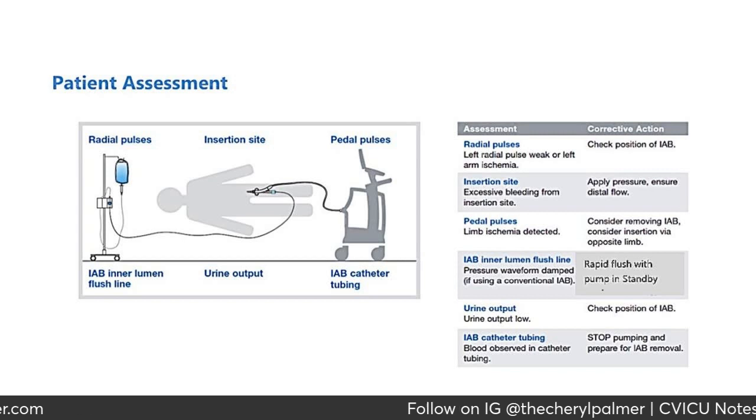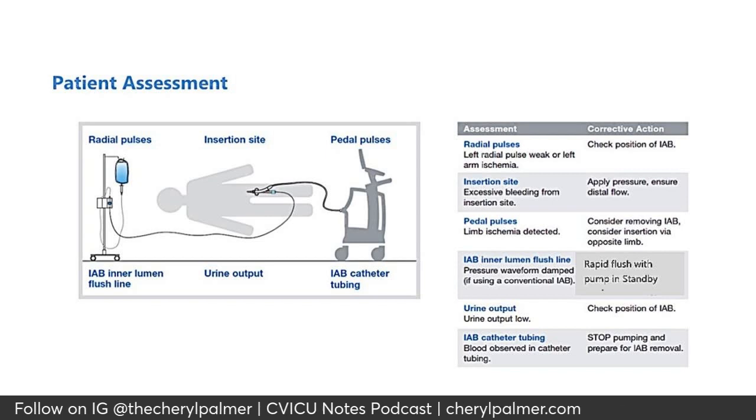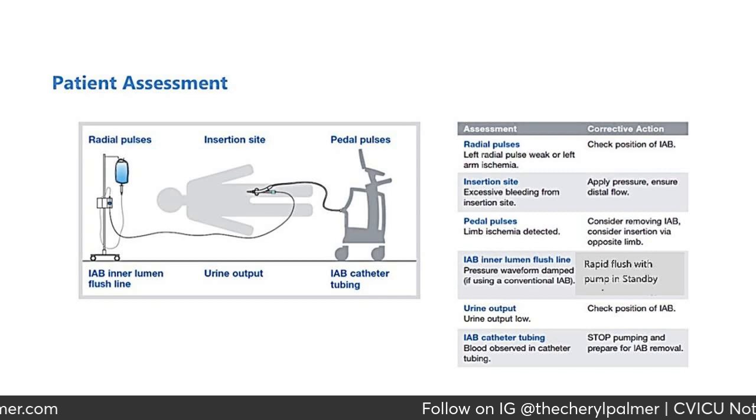if you find any abnormal things when the patient has the balloon pump in place. You also have to remember to instruct your patient that they pretty much have to be lying in a flat position, keeping that limb straight so there's no kinking in the balloon.